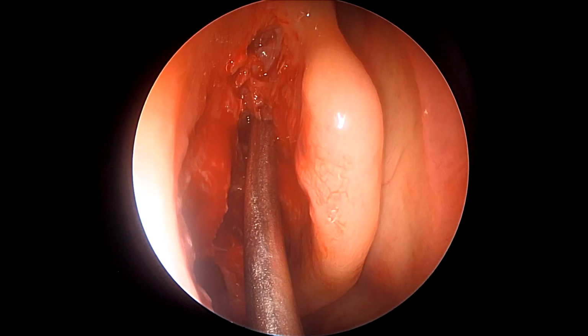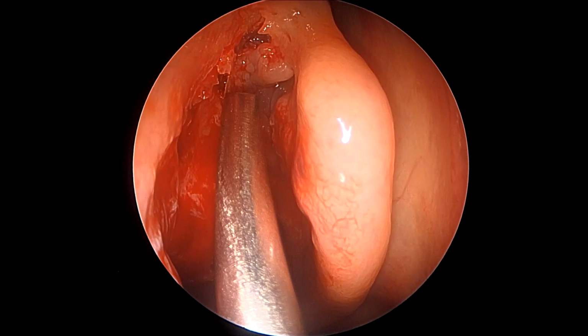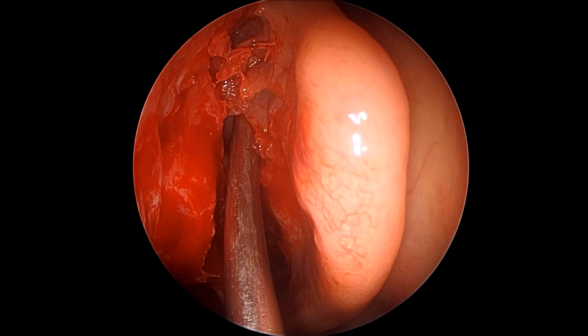We're using a frontal sinus suction curette here to use suction and curette the thin bone of the agger nasi and the frontal cells one by one using the same instrument.